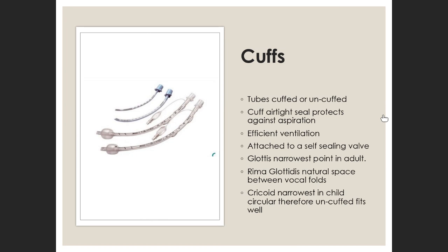Can you hazard a guess what would happen if we were to inadvertently put a tube down that side? You could overinflate that lung and damage it. All right, well, that's a possibility. What else? So what would you see clinically? You would only get air on one side. Well, even if you're getting air on both, it would be more on that side. Good job. All right, so it's more likely in the adult.